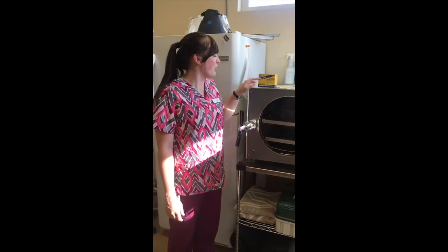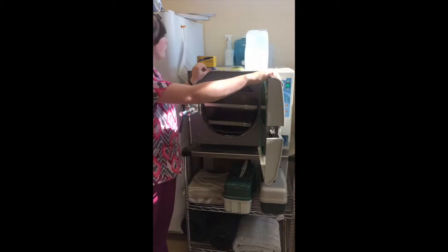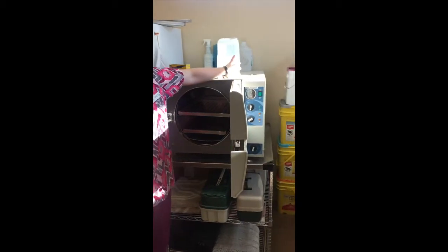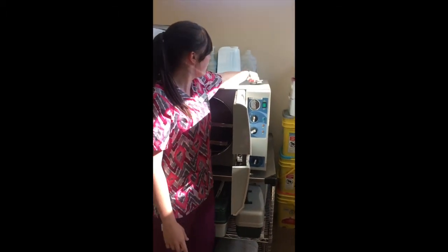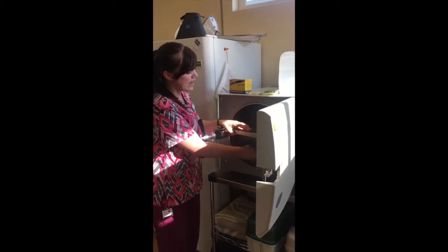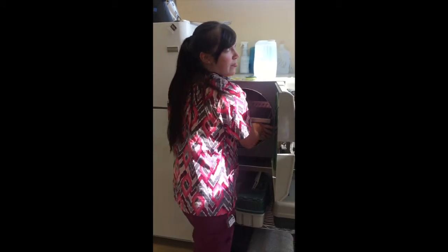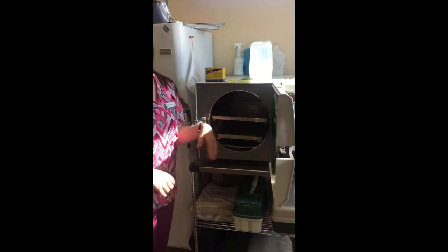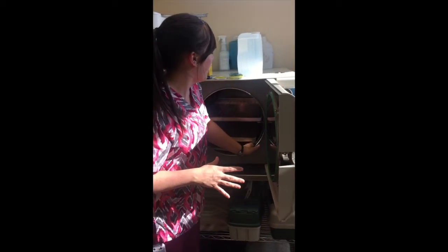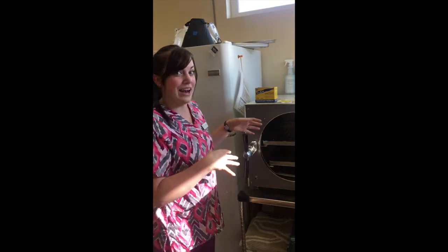Okay, I'm going to be describing how to maintain our autoclaves. This is our autoclave, a pretty big one. When we go to clean and maintain it, we want to drain out all of the water that's in it currently, and our reservoir's over here. We drain all of that out, and we take out each individual tray and holding tray, and we wipe those down with a lint-free cloth, and we set them aside until we can put them back in after we're done cleaning.